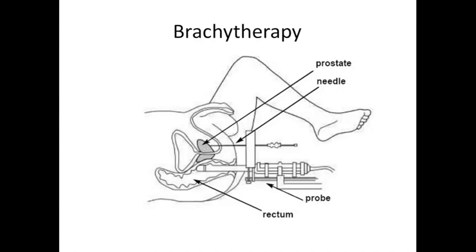So they have a spinal anaesthetic to put them to sleep, just like an epidural. And then they have a light general anaesthetic as well, because it's a relatively quick procedure, about a 45 minute procedure. So we don't want a deep anaesthetic because we want them to wake up and recover pretty quickly.